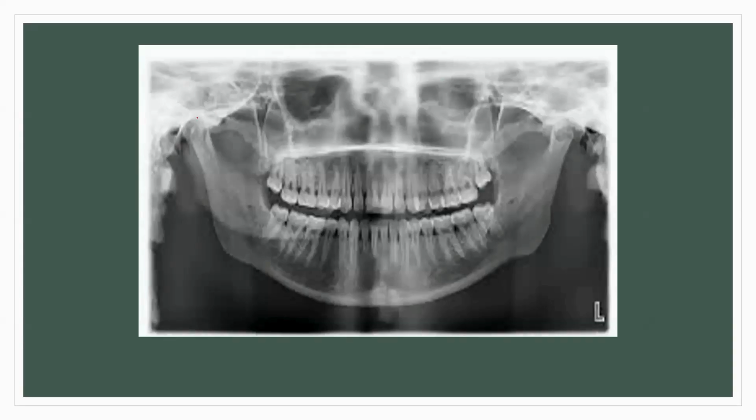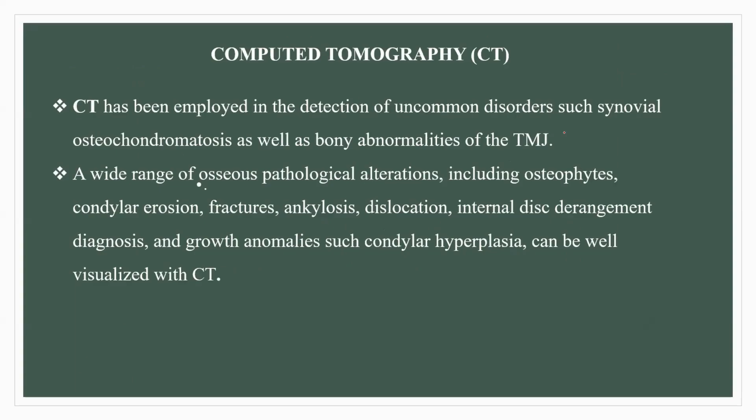Other than that, we cannot see the fossa clearly, but it is a good screening tool to evaluate the symmetry and also if there is anything on the first view. Okay, good screening tool. That is about the panoramic radiography.